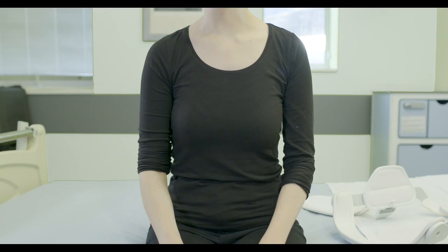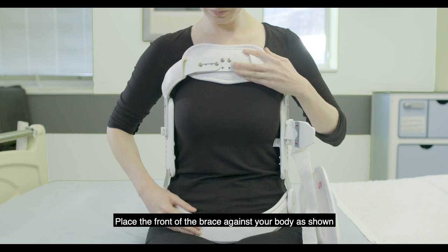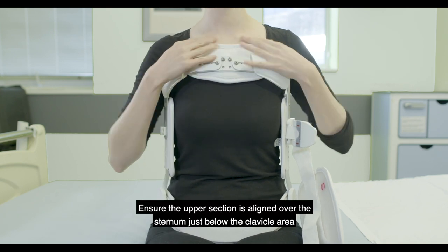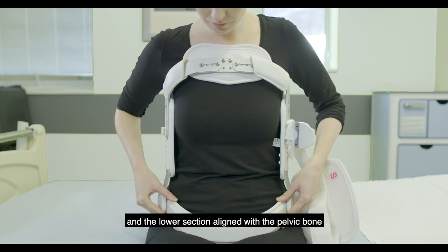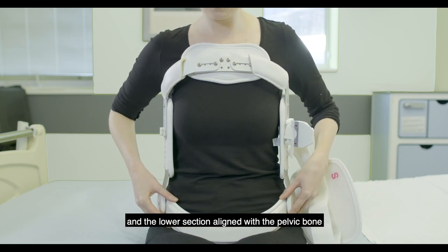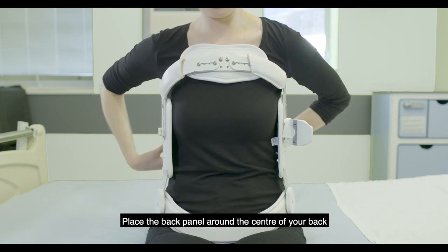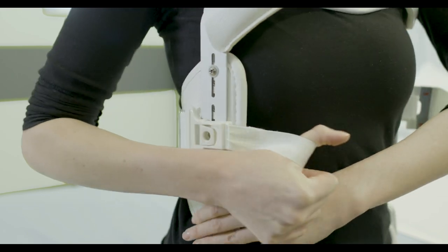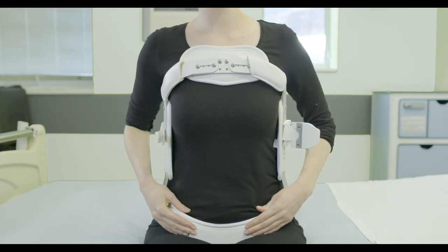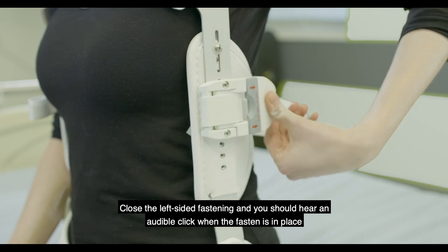Alternatively, the brace can be fitted in sitting. Place the front of the brace against your body as shown. Ensure the upper section is aligned over the sternum just below the clavicle area and the lower section aligned over the pelvic bone. Place the back panel around the centre of your back and fasten the right sided hook fastening. Close the left sided fastening and you should hear an audible clip when fastened in place.